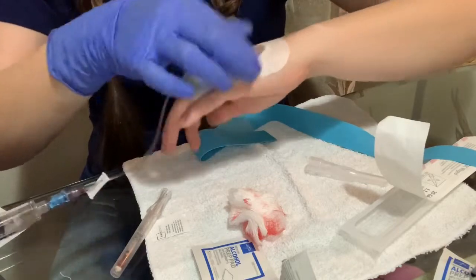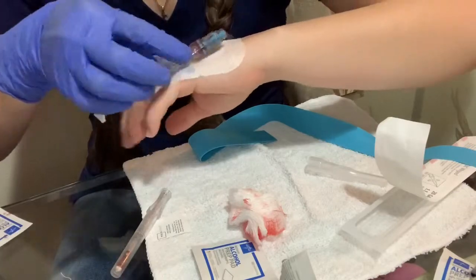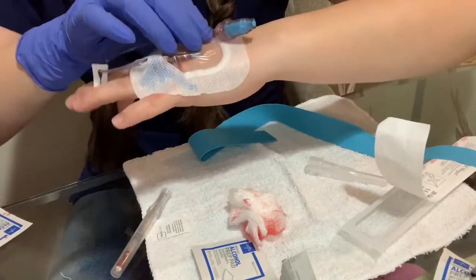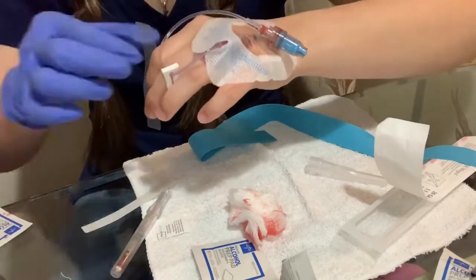Remember, always use one needle per attempt and a maximum of two attempts. Now we just have to secure the catheter.